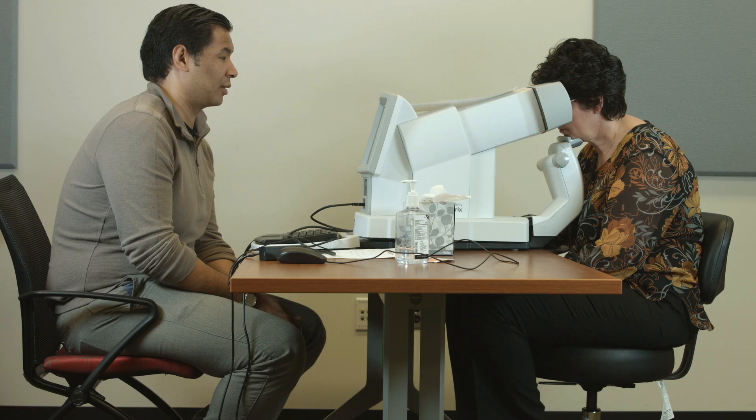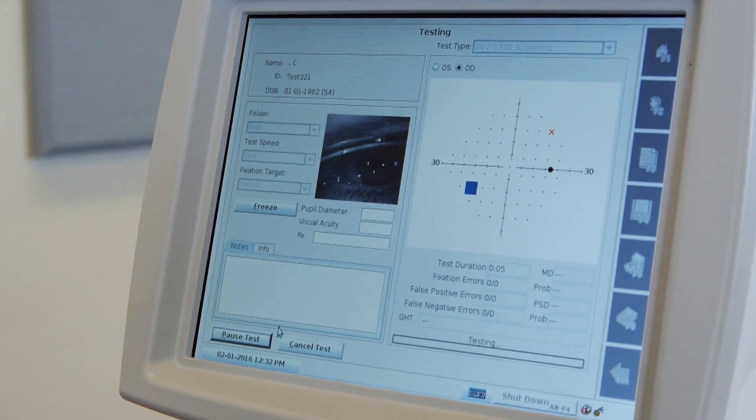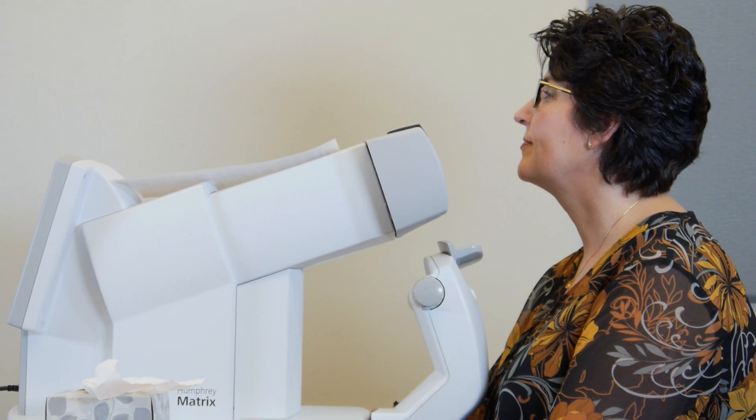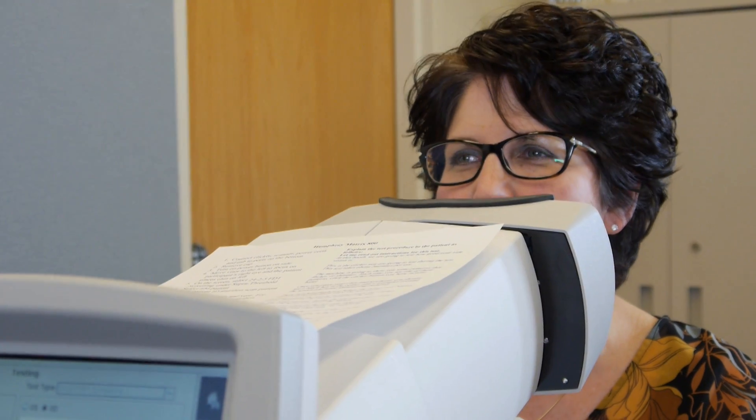Issue 1: Patient is clicking the button too much. Pause the test. Review the test instructions with the patient to only click when the shimmering pattern appears.